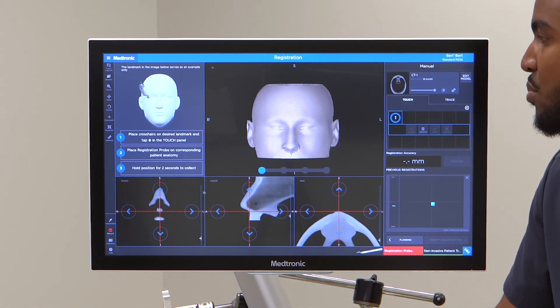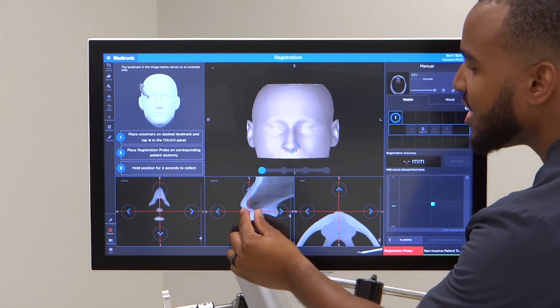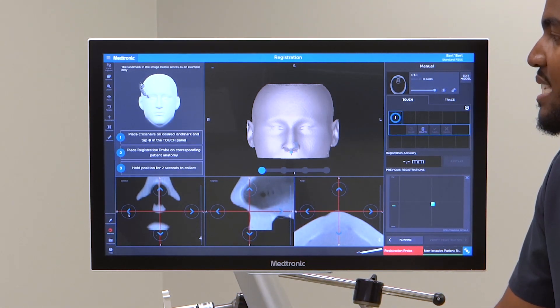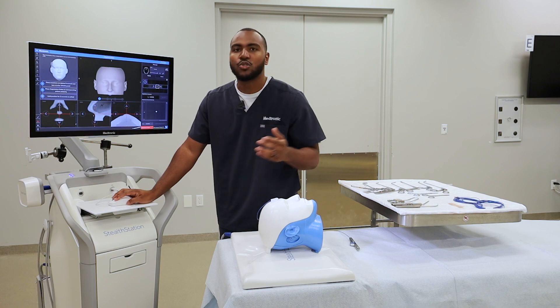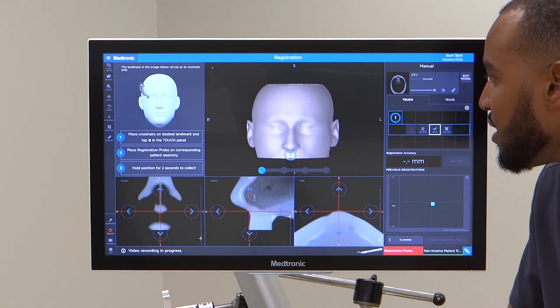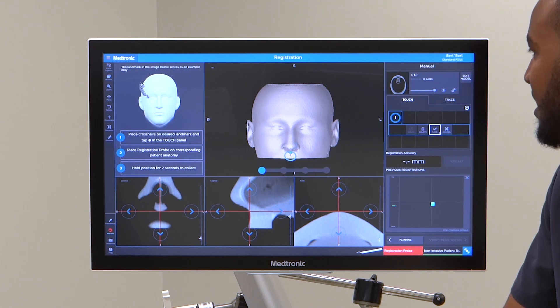I got the first point on the columella. You can zoom in here and also refine that point to exactly where you want it. In these instances, you do not want a floating point. Zooming in helps you ensure that no point is either floating or embedded. After you refine that point, you'll want to hit save.